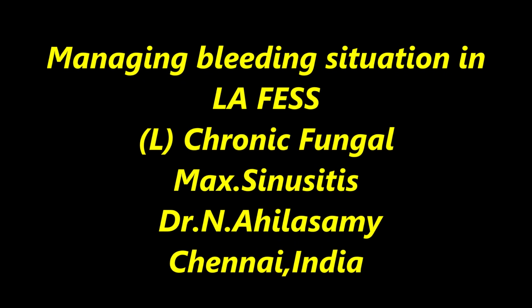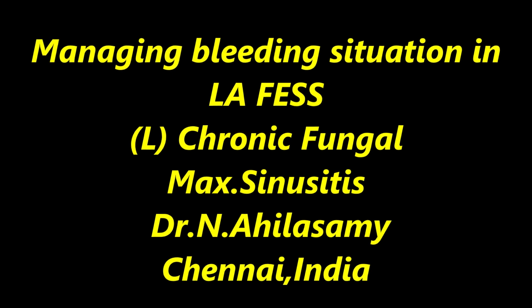I am going to show a case of left chronic fungal maxillary sinusitis, managing the bleeding situations or a bloody area under local anesthesia.